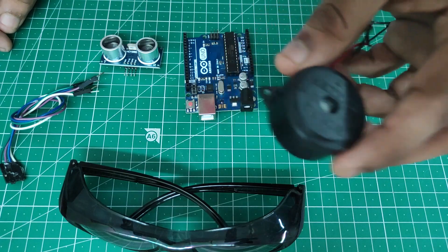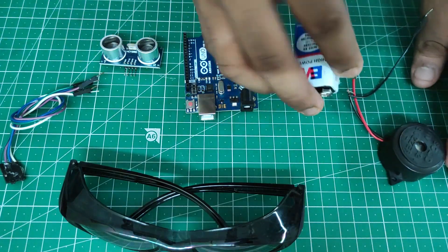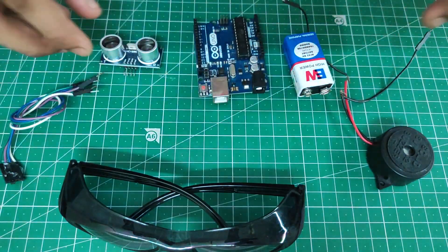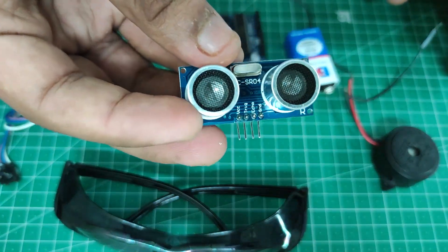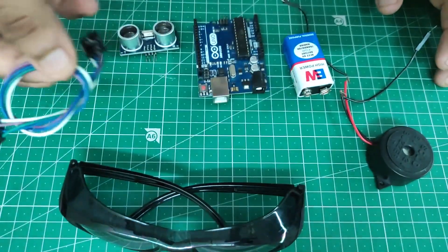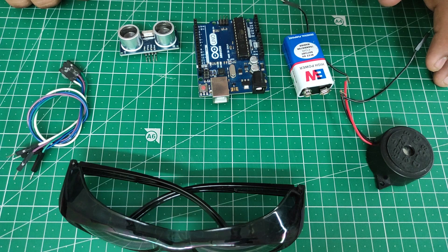Components needed: a DC buzzer, a 9V battery, the main component an Arduino Uno, an ultrasonic sensor HC-SR04, and jumper cables. Now let's start wiring the circuit.